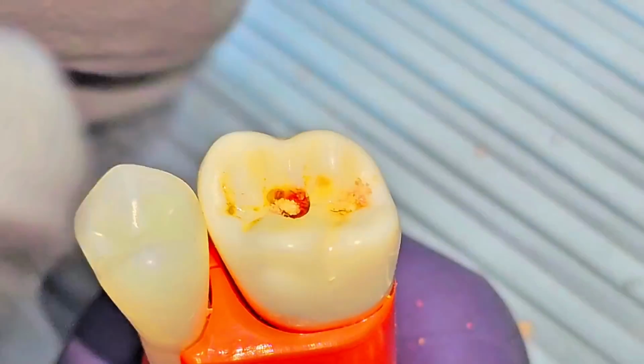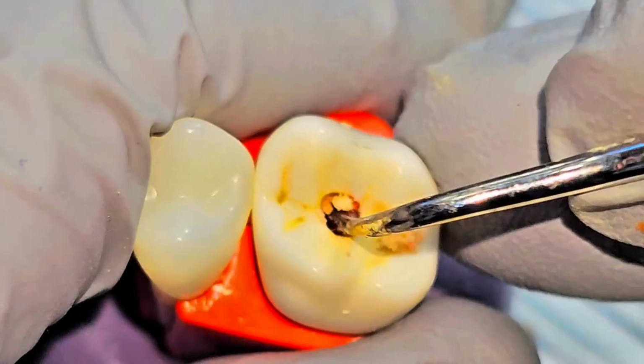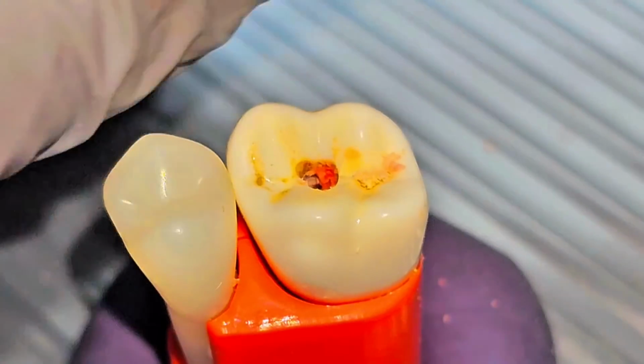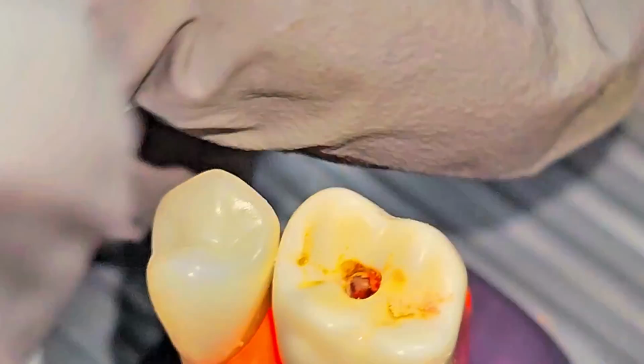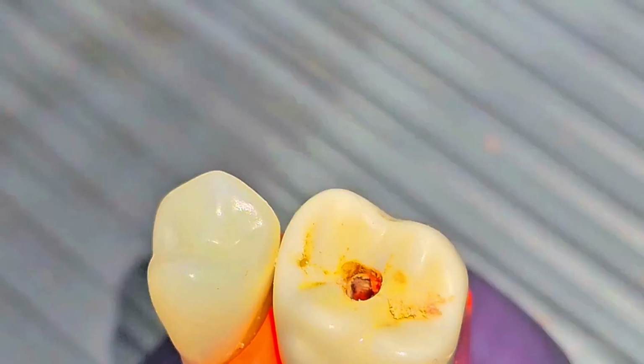I didn't put the rubber dam here, but when you're actually working on it, you need to put the rubber dam, but not on the tooth that you are working on, because this tooth is very fragile. I don't want you to have any deduction, or to repeat the procedure because the tooth broke. Yeah, this one just fell.